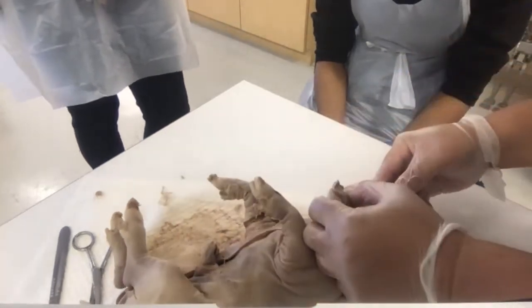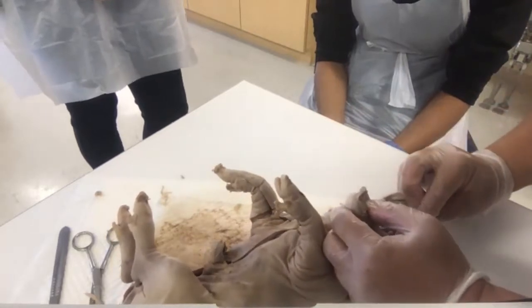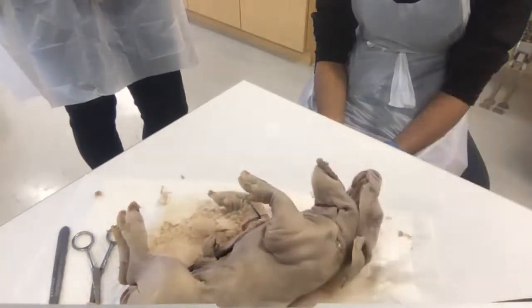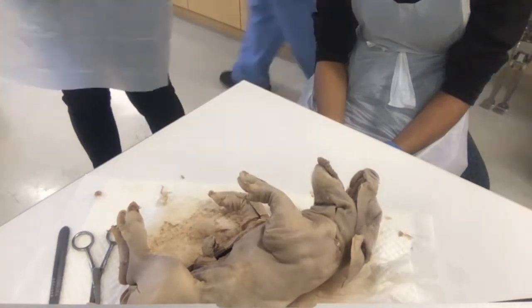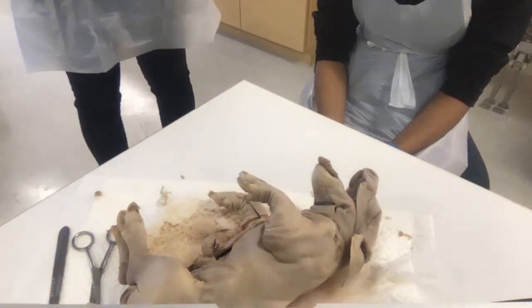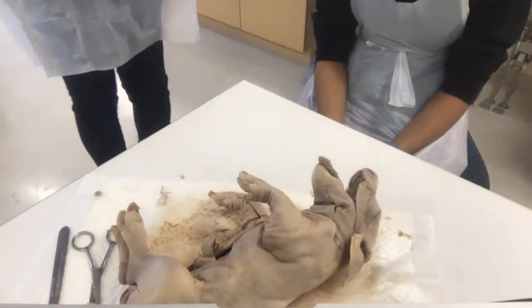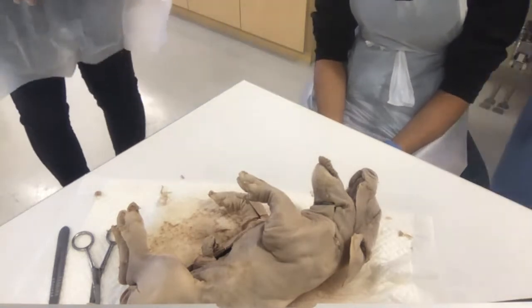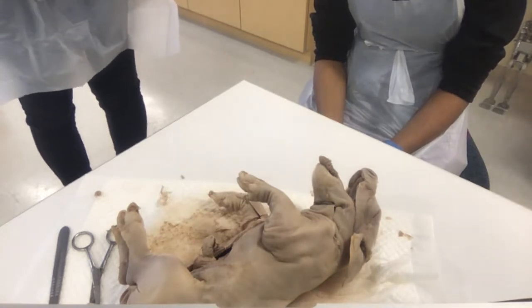Let's see if we can look at some glands. Yeah, you can. You know what? This is our lovely gooseneck light. We use this in clinical, especially in ENT and obstetrics, because you need a concentrated light source.